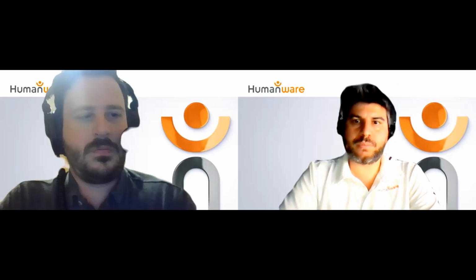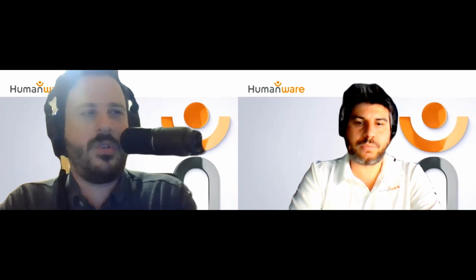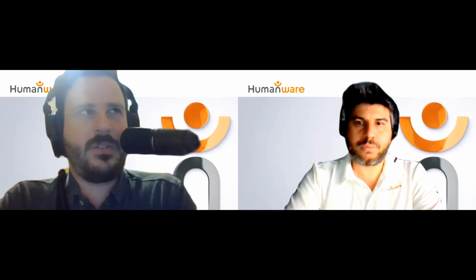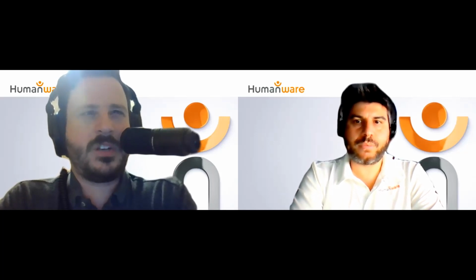Meeting. All right. The piece of this, and we're running over, which is fine. We will have time for a couple of questions. But I do want to spend a minute or two talking about why somebody would choose a Braille display over a note taker, because it comes up all the time.